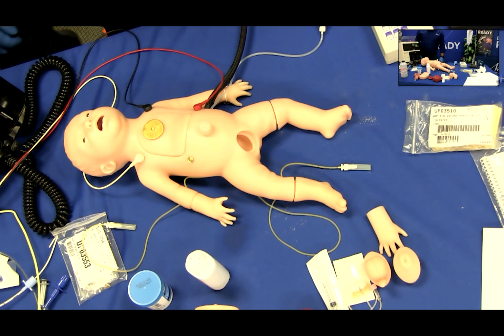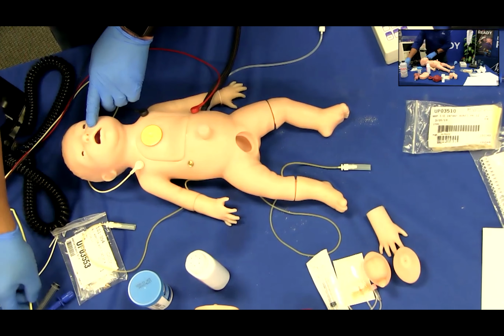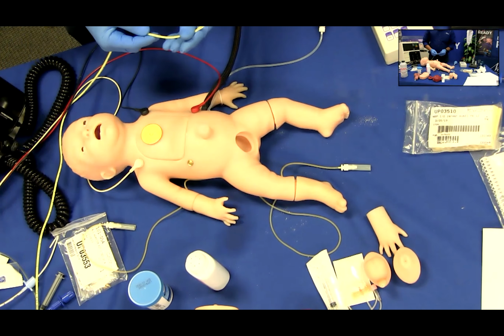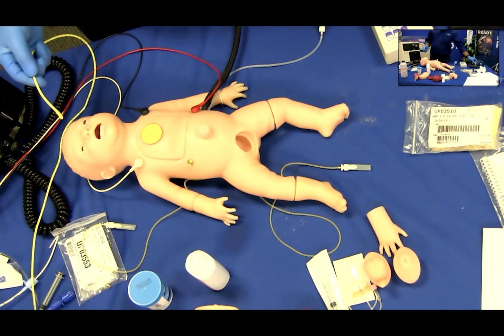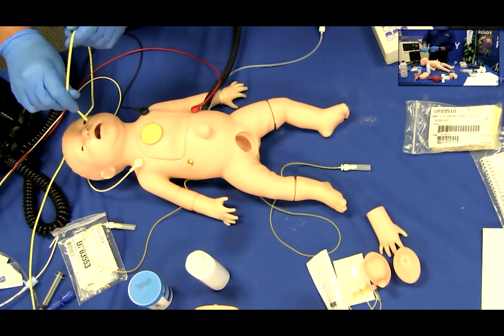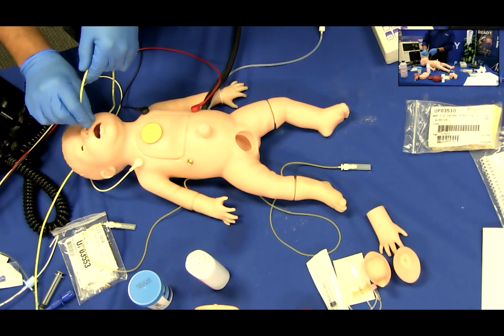Gastrointestinal. The left nostril will accept an 8 French NG tube that will pass into the small tube embedded into the chest cavity of the infant simulator. It is important to note that this is for tube placement only, and no fluids should be infiltrated into the simulated stomach cavity.